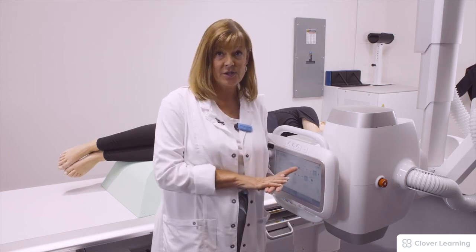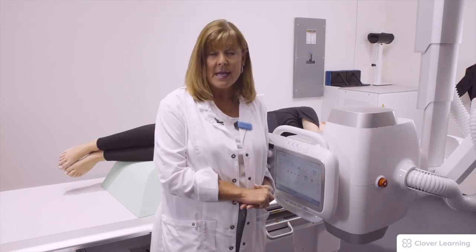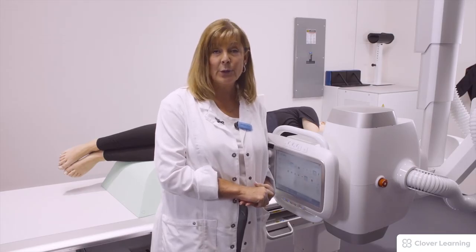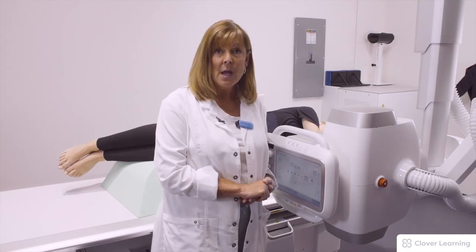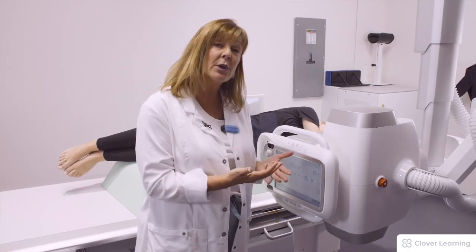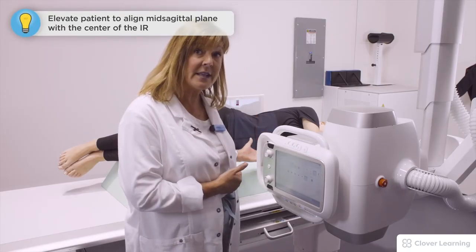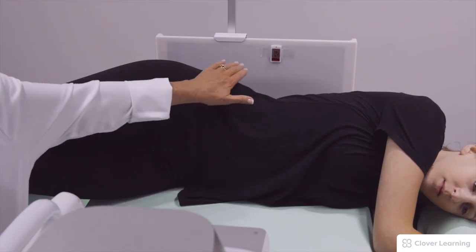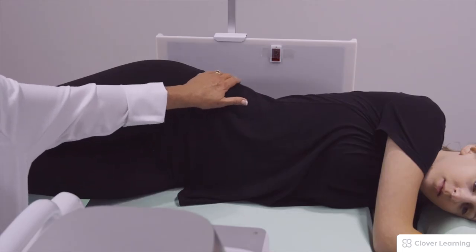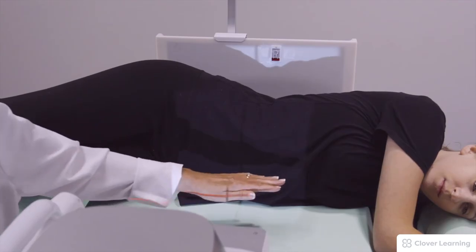This wait time allows the air and fluid to separate so you have a distinct air-fluid level. My patient is on her left side. I have built her up with sponges so that she is higher than the level of the IR. I have indicated a right marker for the right side that is up in the air.